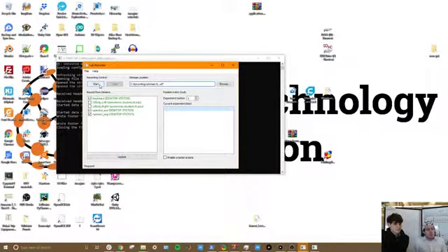And that way you have enough time after when events occur and before when those events occur to be able to do time shifting around the signal and not worry about there being some noise from them getting ready into a position where they're comfortable to wait to start doing the experiment. So it's just accounting for various different potential factors that could be creating issues in your recording.